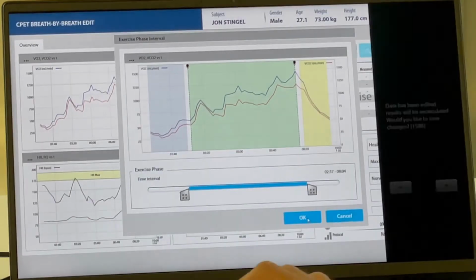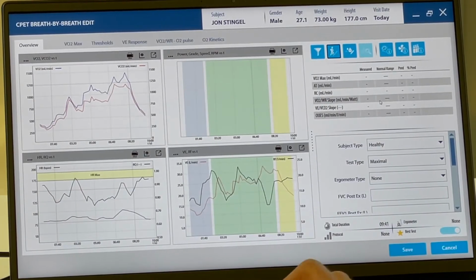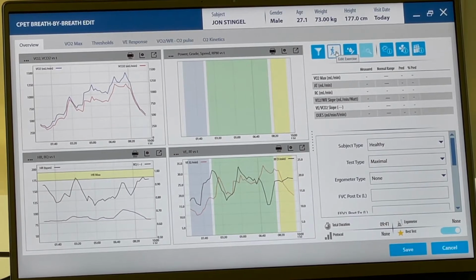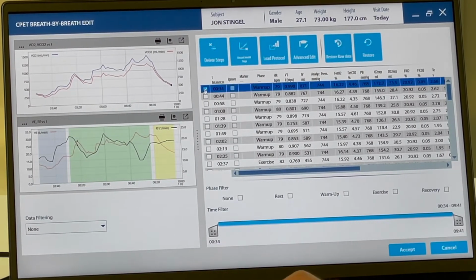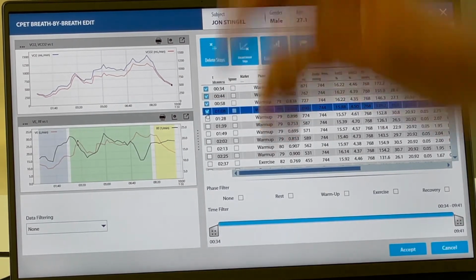So what if... Because if there's a way to just manually repair that gap, then we don't have to rerun a subject. Right. So right here, you can choose the steps that look funky, and you just delete them out.